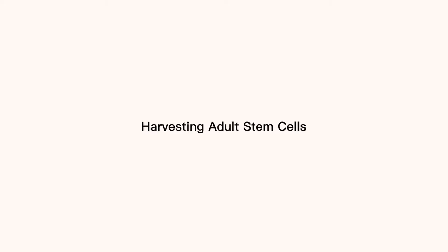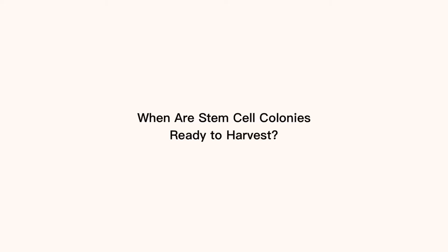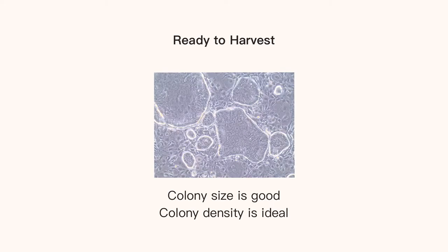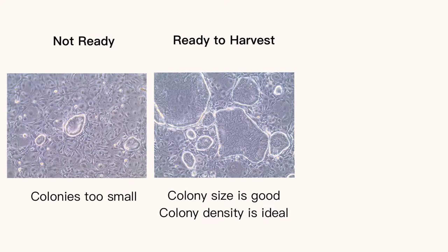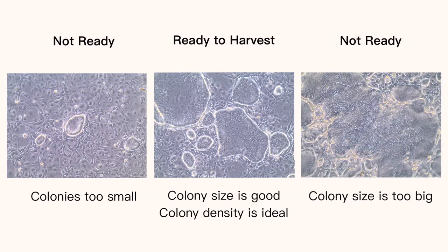Mimics expansion media is designed for the rapid proliferation of adult stem cells. Adult stem cells are ready for harvesting when they have reached 70% confluency. The size and spacing of colonies within the plate are important when identifying whether your cells are ready to harvest. The image on the left shows adult stem cell colonies that are well spaced but too small for harvesting.